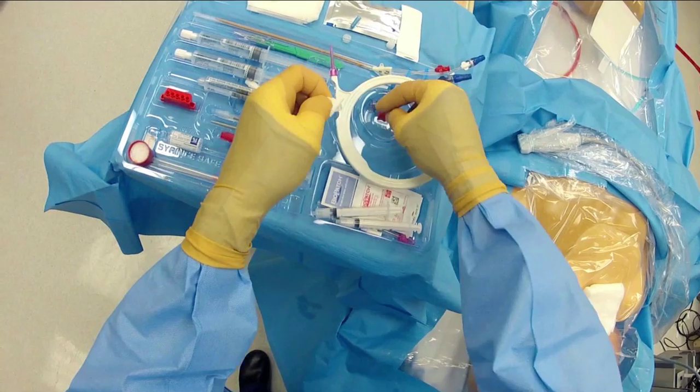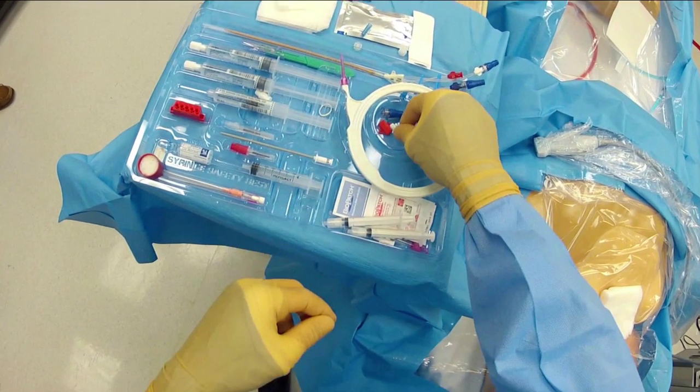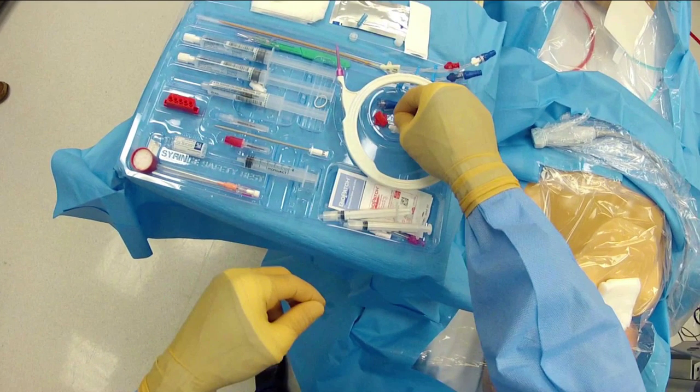The next step is to take the skin lock and open it up, spreading the white wing by breaking the seal. It's much easier to do this now before placing the catheter than when your hands have blood or gel on them while you're trying to secure the catheter.